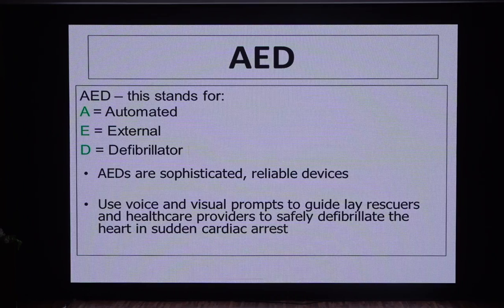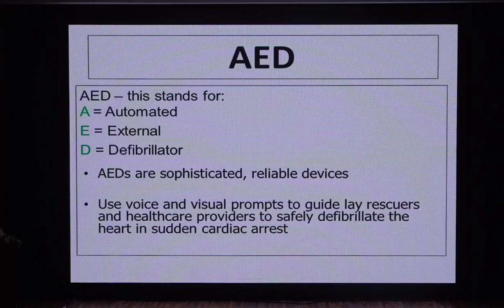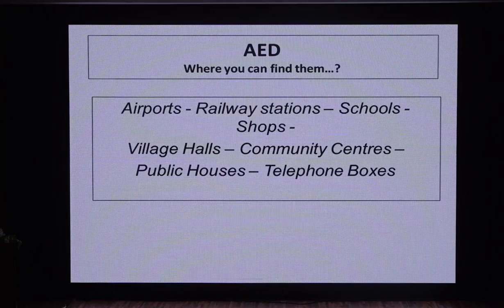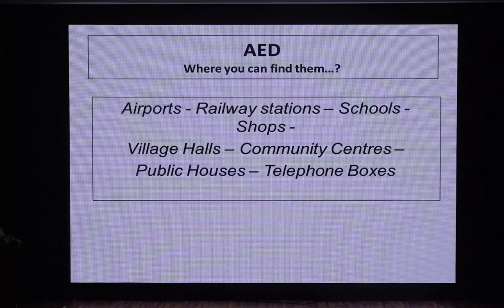And it's a very, very simple device. It follows visual and voice prompts, so you don't have to do anything. You just have to remember one thing. They are available in many kinds. You can find them at airports, railway stations, schools, shops. Please, whenever you go to a mall next time, please take out 2 minutes and see where the defibrillator is. If you go to a railway station, please see where a defibrillator is. You will actually find the government of India has done a great job putting up AEDs everywhere, all over the public places, right?